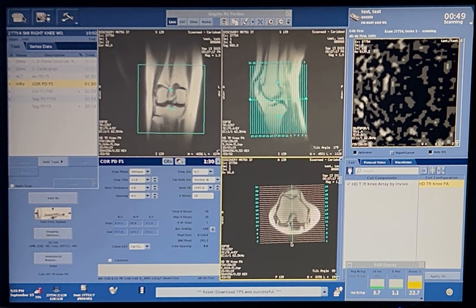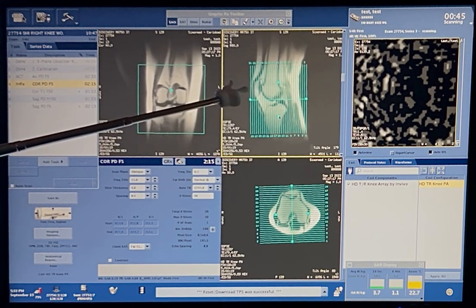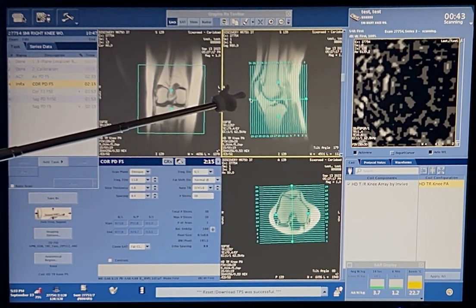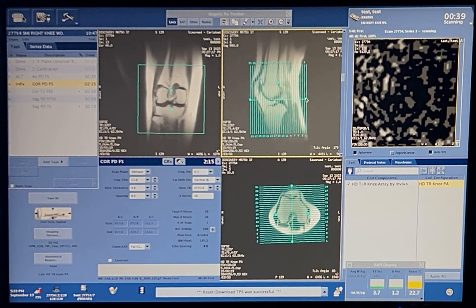Okay. Alright. So now we want to cover this. I like to cover everything in front of the patella personally, but you don't need the posterior fat of the knee. You only need the muscle. So let's cut, yeah. One more, or two more, sorry, three more. One, two. No, well, yeah, let's leave it like that. Okay. I like it like that.